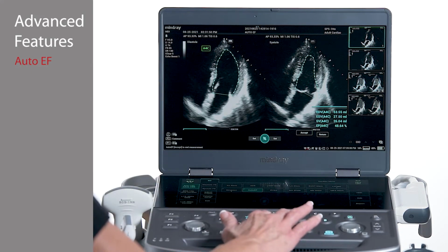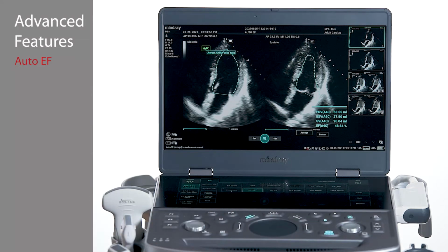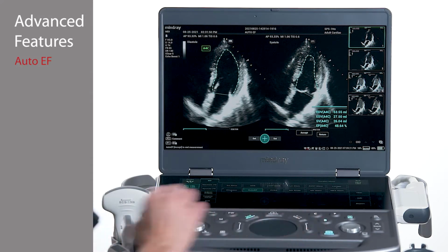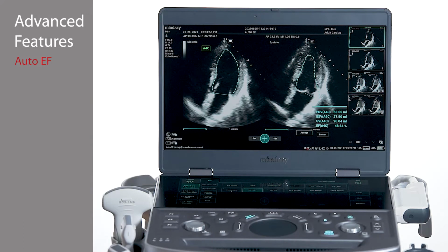The system automatically identifies these two views. However, click on the view label in the upper left if it is misidentified, and the system will reanalyze the clip. A progress bar will be displayed along the bottom with results.